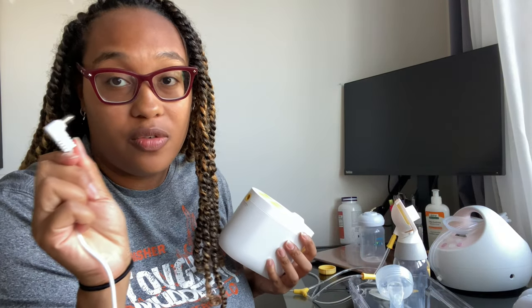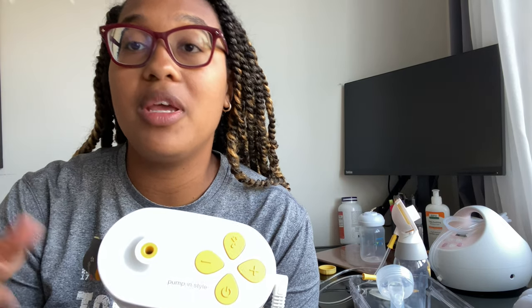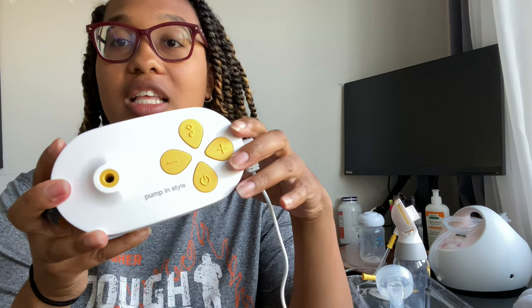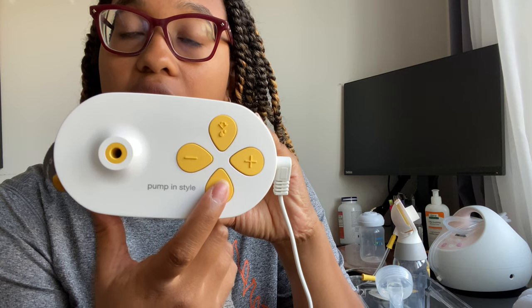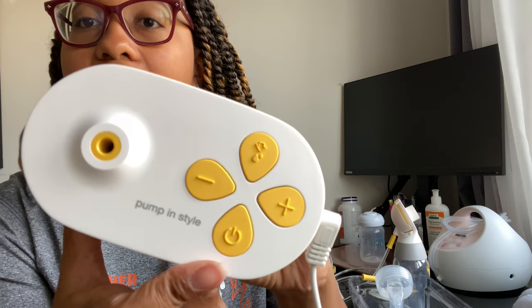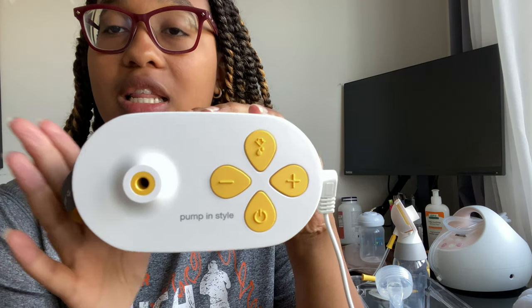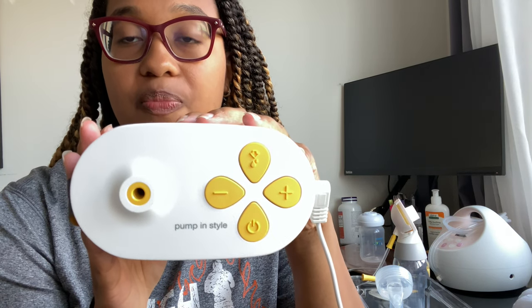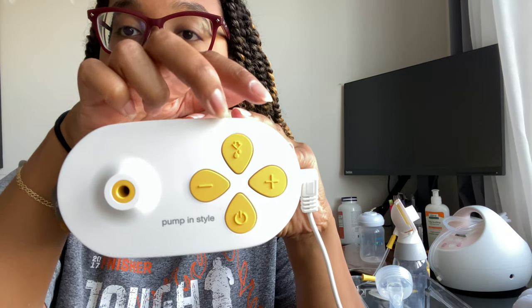With the Medela Pump in Style, this is what it sounds like. I'm going to use the Spectra port on this just to give it power to show you. You press your power button and it starts automatically in letdown mode. So that's what your letdown sounds like. It typically stays in this mode for two minutes, then automatically transitions over into expression. But if you see your milk starts flowing already and you want to move over, you just hit this button here and you hear the difference.